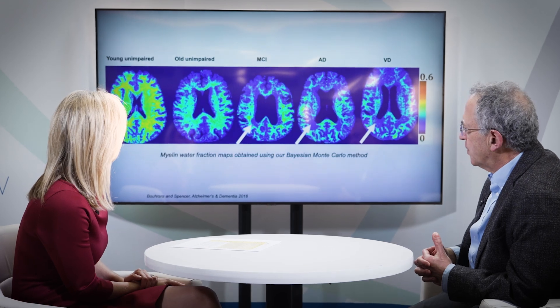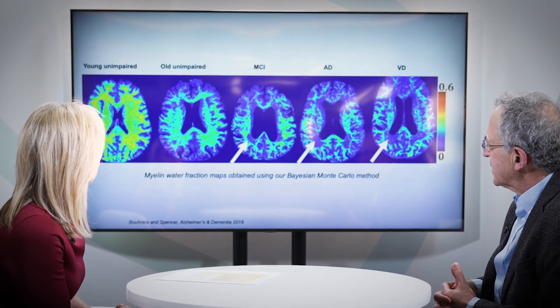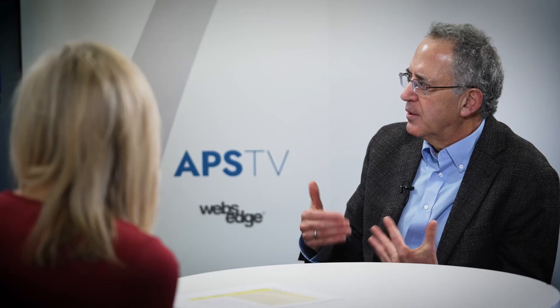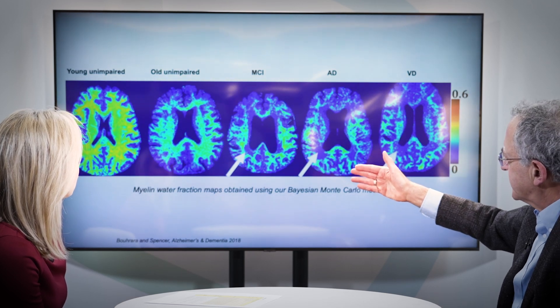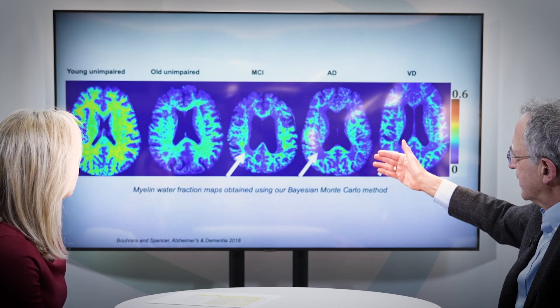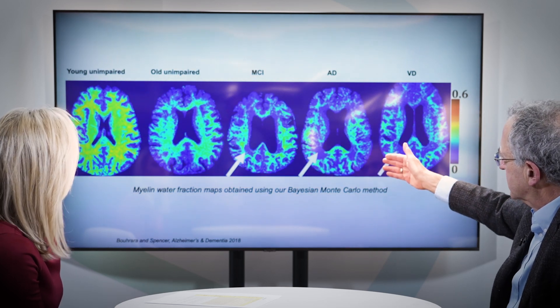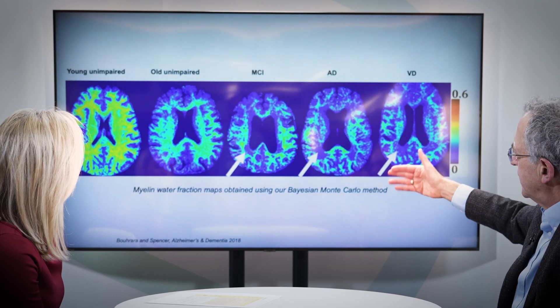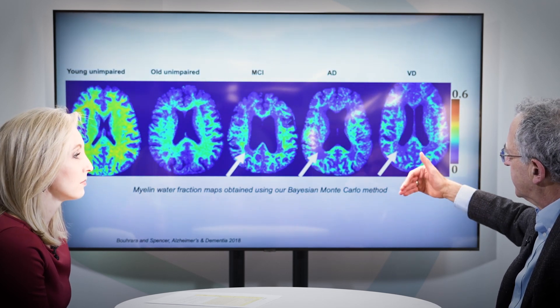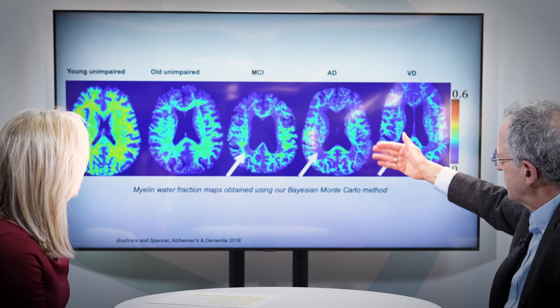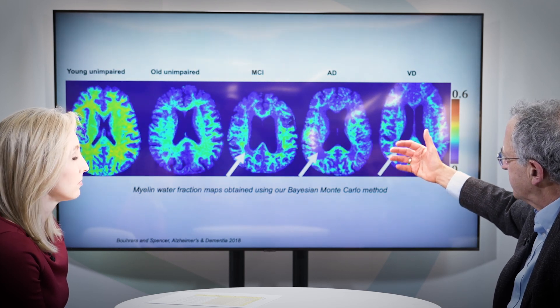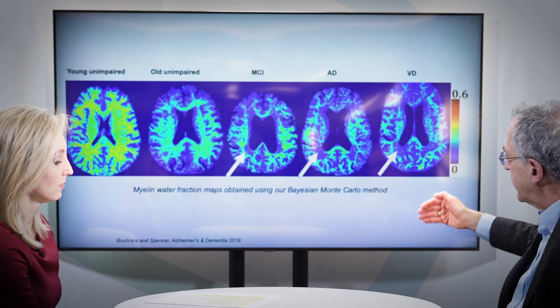Can you give us an example of some of the results that you found using this process? These are all myelin water fraction maps. Myelin water fraction, coined by Alex McKay in the 90s, is a quantitative way to look at the amount of myelin in a way that is proportional to the signal that we see. The young unimpaired is the standard — that's what we would all like to see. In older subjects, you can see there's a loss of myelin with much less bright yellow coloration throughout. Mild cognitive impairment — a condition that can be viewed as a stable condition of impaired thought or a precursor to things like Alzheimer's disease — shows focal loss of myelin, where brightly colored regions are replaced by darker blue. In Alzheimer's, that progresses to an even greater extent.